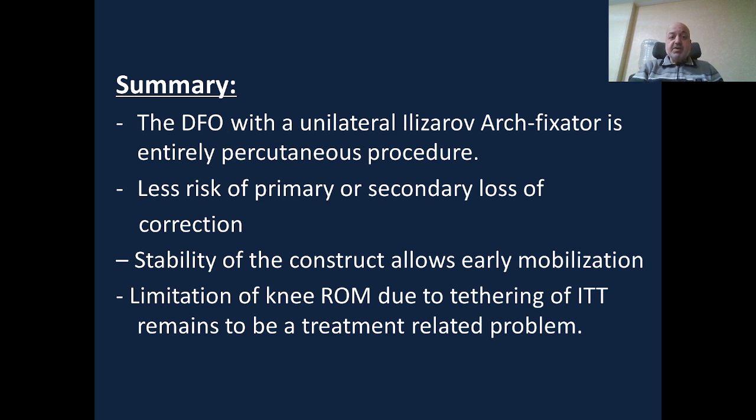The distal femoral osteotomy with a unilateral Ilizarov arch fixator is an entirely percutaneous procedure. There is less risk of primary or secondary loss of correction. Stability of the construct allows early mobilization and even weight bearing. Limitation of knee range of motion due to tethering of the iliotibial tract remains a treatment-related problem.